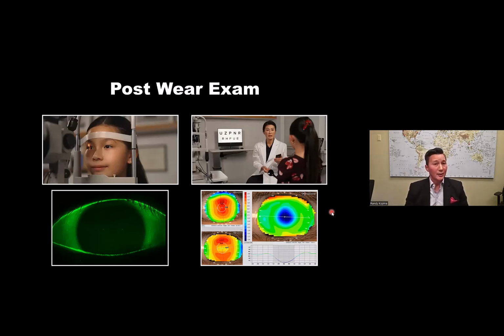And this is a helpful tool because often after one night, you have not achieved full effect. You may be 70% there, but the patient only knows what should be perfect and what's not perfect. So if you can help them to appreciate that you've just improved by 4 lines of vision, then they understand that the process is taking the time that you said it was going to take, that after one night there'd be improvement, but we probably wouldn't be at 100%.